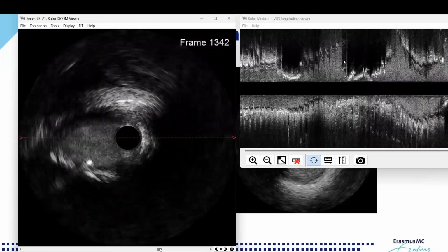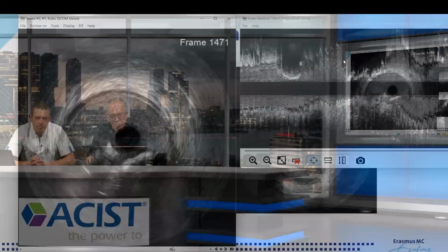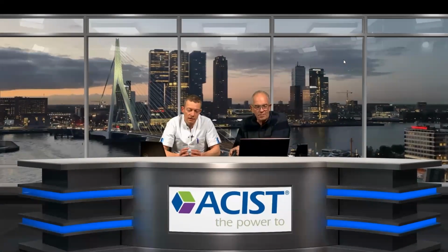There's not much certainty in what we do, and the only thing that you can say is that after the balloon, we didn't do anything. After the shockwave, things improved. Whether it was enough, I mean, you never know. The issue, though, is that in this case, the calcium was already significantly modified. You saw the dissection. In these cases, I would be highly reluctant to use atherectomy, because the plaque is now floating partly in the lumen area.